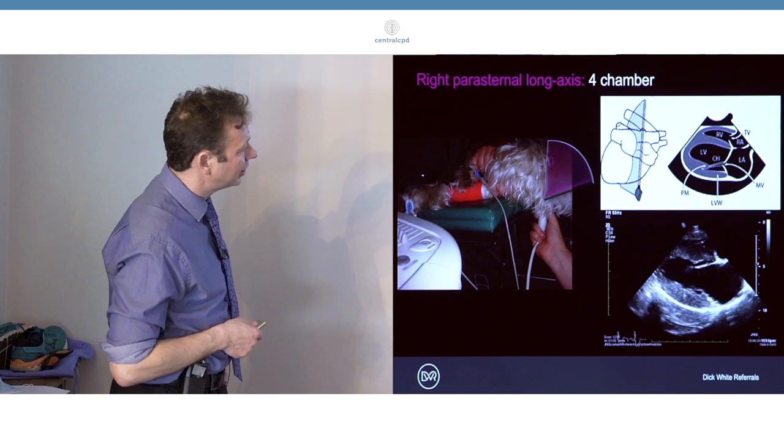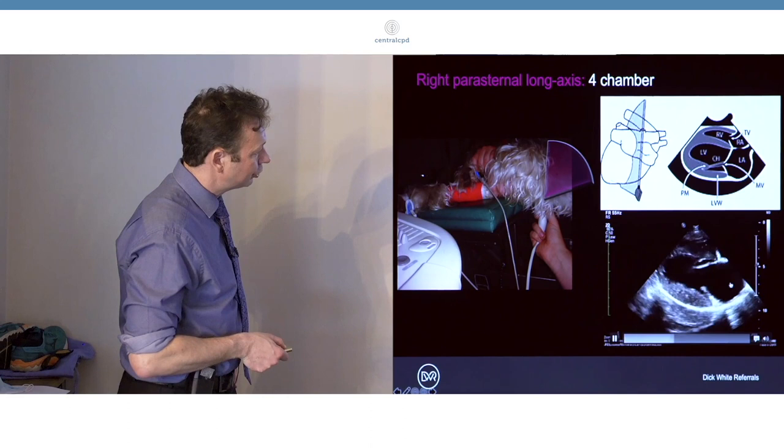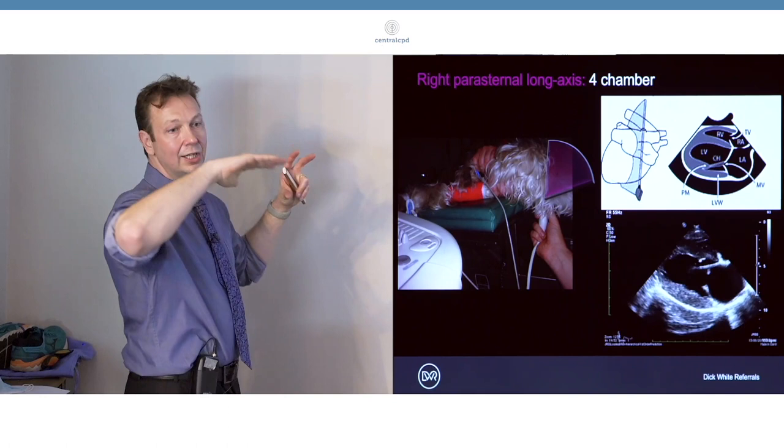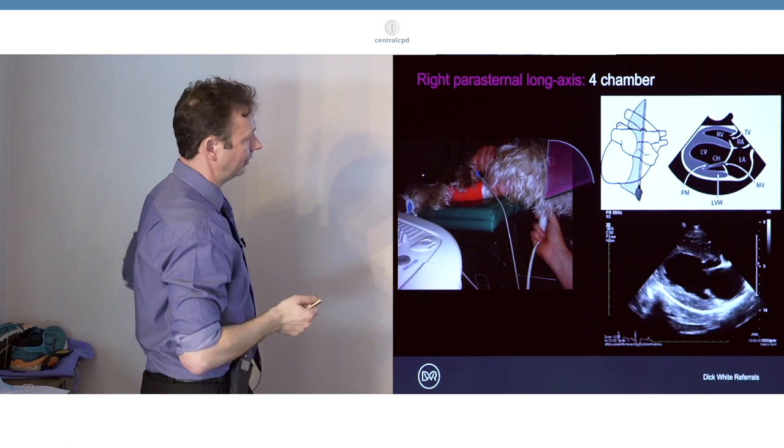So this is what our four chamber view looks like. On our image we've got the left atrium to the right of the image. Conventionally we want to orientate the probe so that our image has the dorsal and cranial structures to our right when looking at an ultrasound image.